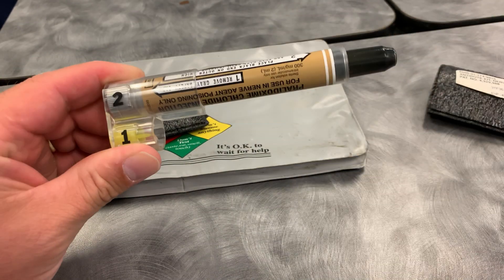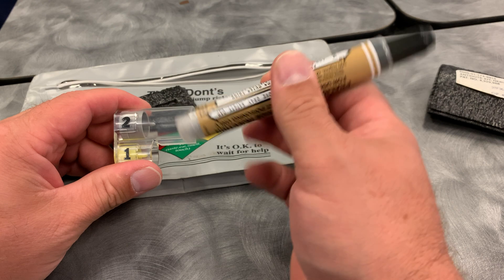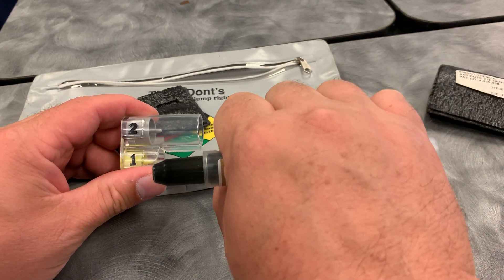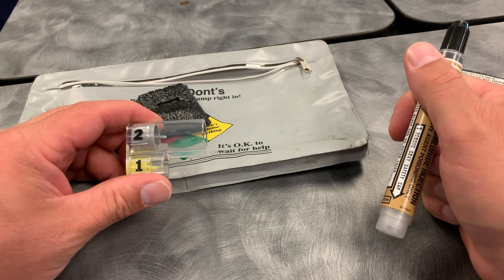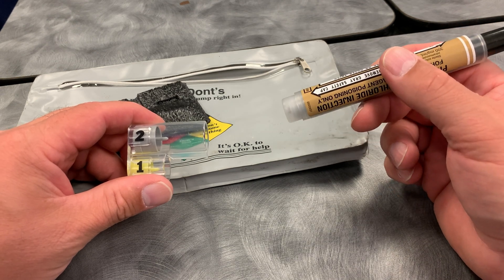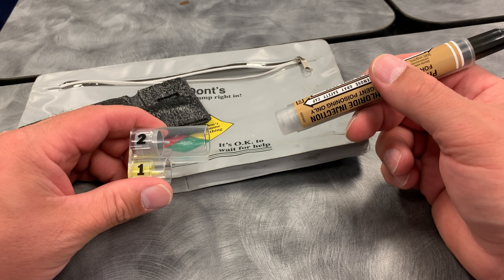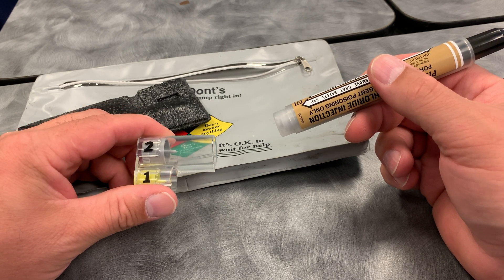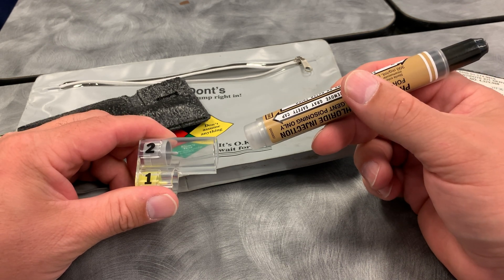Then number two — same thing. Hold the auto-injector, push it against your thigh, and hold it there for a couple of seconds so the medicine fully ejects. Record the time and dispose of it. You've now administered your antidote. This will not work against everything we're exposed to, but for many chemicals and toxins at a hazmat scene or terrorist act, these will help. Remember: these are only to be used for you, and only if you get exposed.